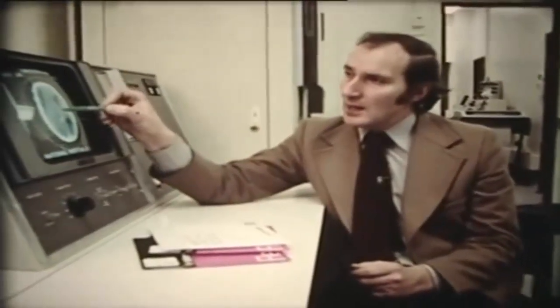At London's National Hospital, we have an example of the most common condition which can occur after head injury. This is a collection of blood between the brain and the skull itself, which presses on the brain and can indeed result in death. To show this before the advent of CT would have meant carrying out cerebral angiography with injections of rather toxic substances into the arteries leading to the brain.